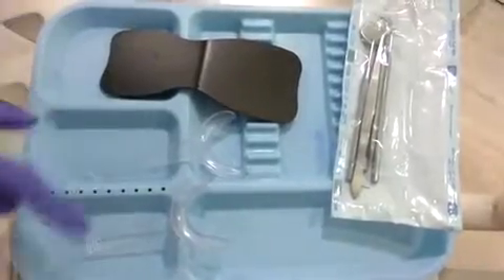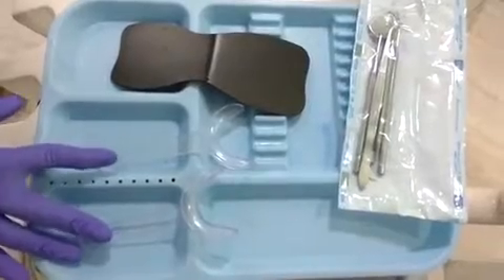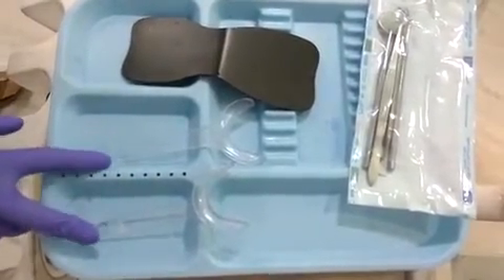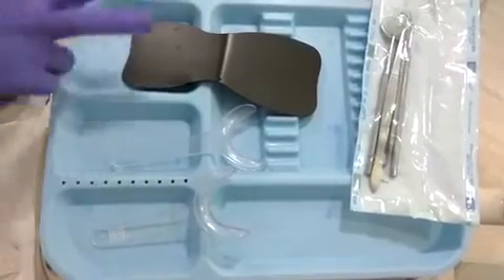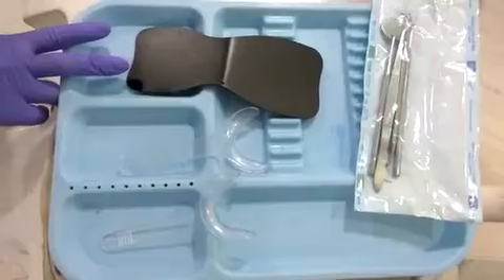We have the contrastor and cheek retractor ready. We place the cheek retractors — I prefer these kind because it's easy to pull the cheek and get a good retracted view. Then we place the contrastor, hold it with one hand and hold the camera with the other, and shoot a picture.